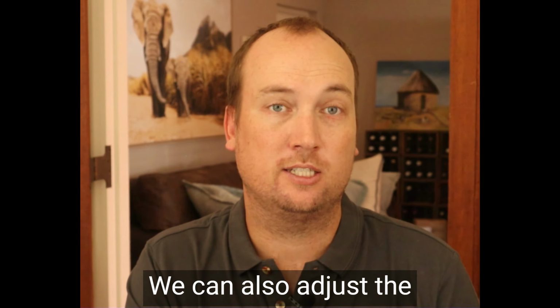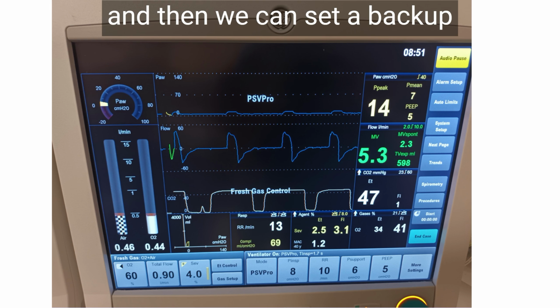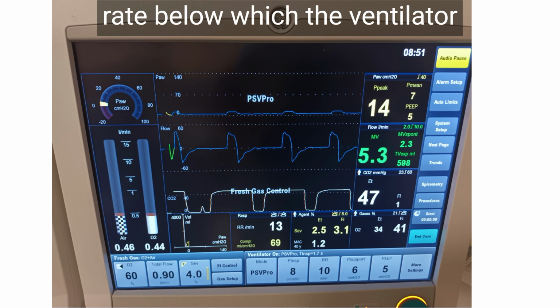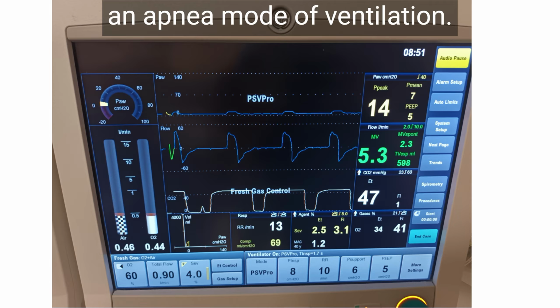We can also adjust the PEEP as we can in all the other ventilatory modes, and then we can set a backup minimum respiratory rate, which is a spontaneous respiratory rate below which the ventilator will activate a backup mode or an apnea mode of ventilation.